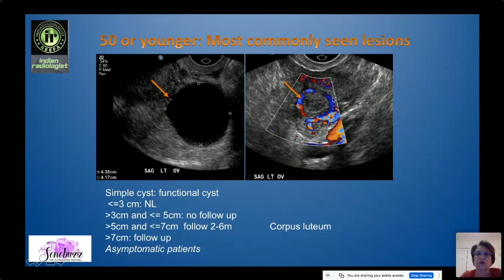This is an example of a corpus luteum, which shows fluid with vascularity around it. Because of this vascularity, they can sometimes bleed and become hemorrhagic cysts.